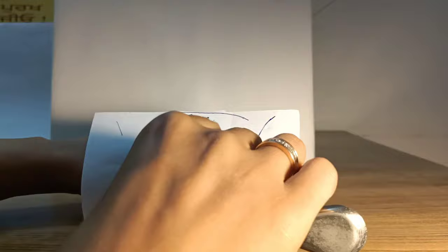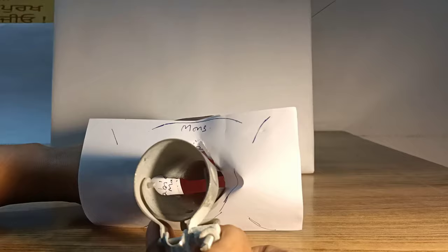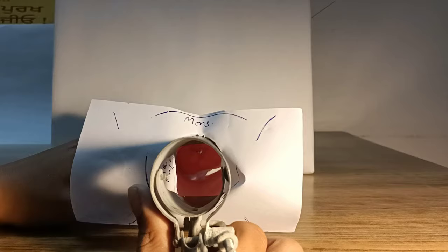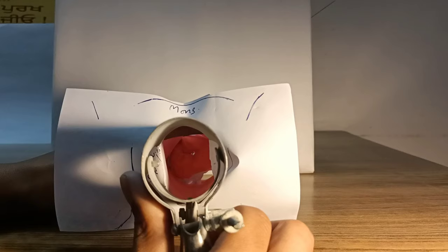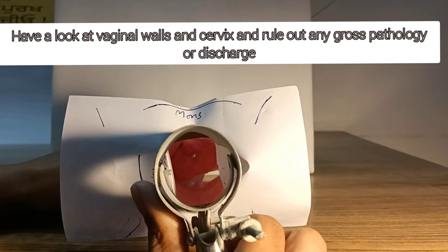Now the anterior and posterior vaginal walls have been retracted and you can see that the vaginal walls appear pink and the cervix is also seen in the center. Here I can see in the center of the cervix is my os.